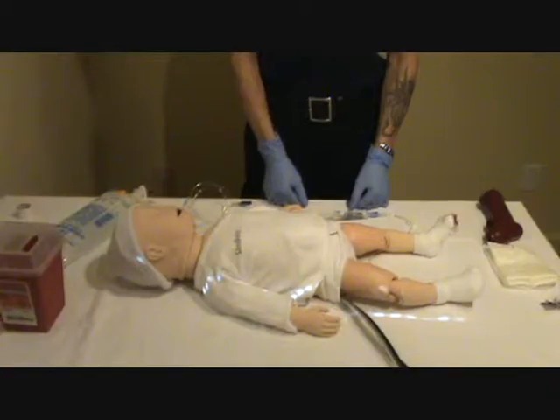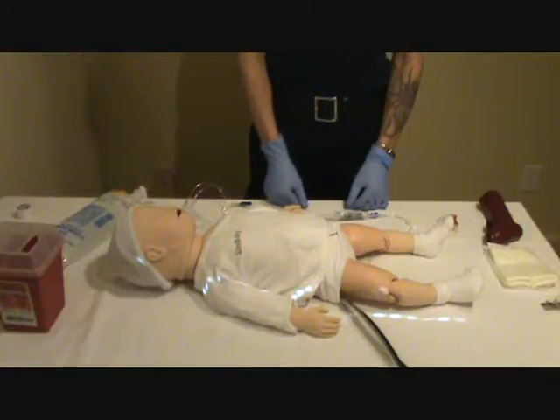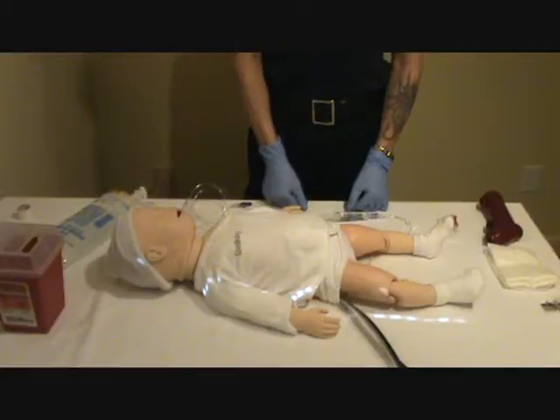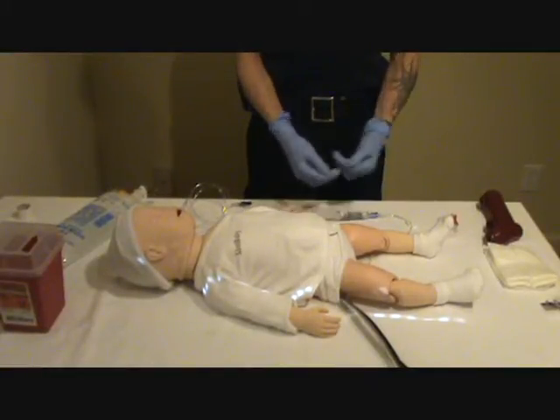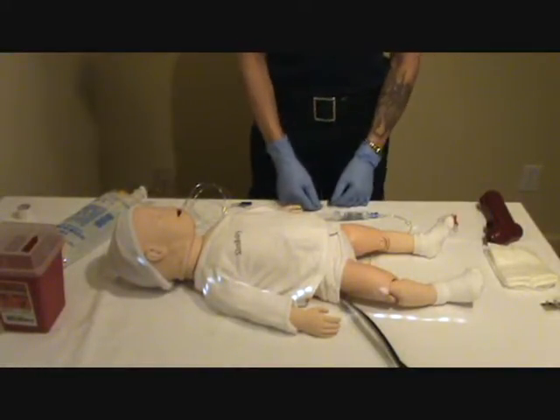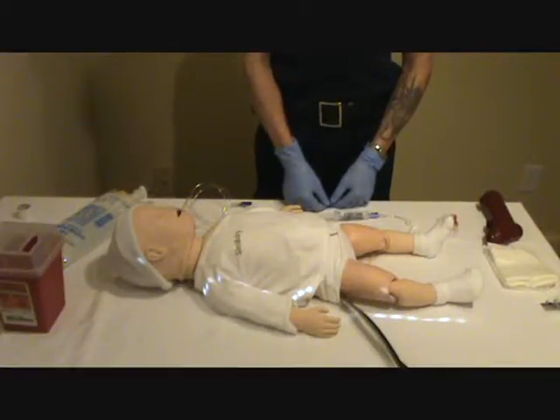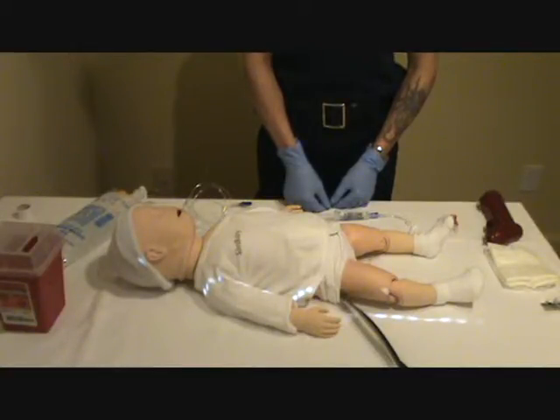Hi, this is our demonstration for the Interosseous 101 EZ-IO. And in this process, the first thing we want to do is make sure that you protect yourself using body substance isolation. You've already identified the patient as a candidate for EZ-IO insertion. You've gone through the contraindications, found that the patient has no contraindications to use of the EZ-IO, gone through the considerations, and taken those into account when deciding what you want to do as far as cannulation for this patient. The first thing you need to do is go through your setup.